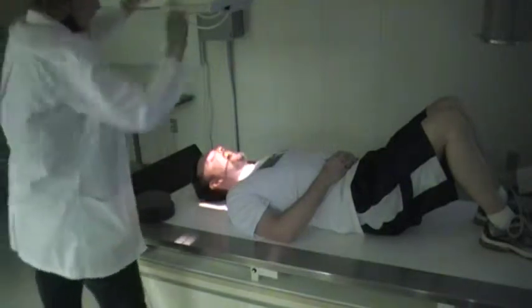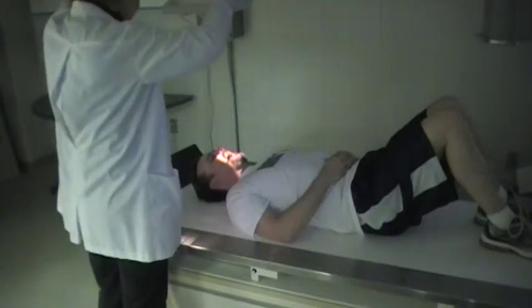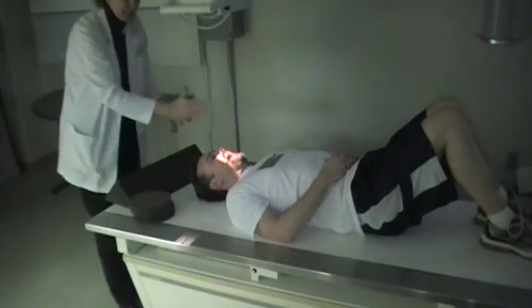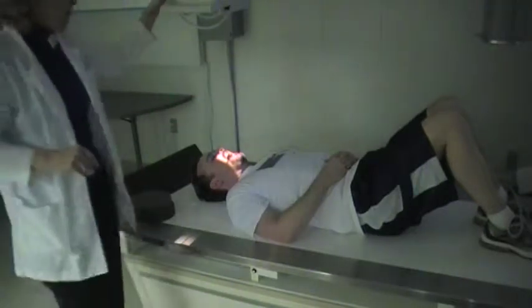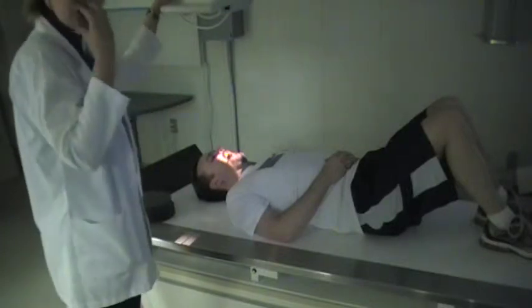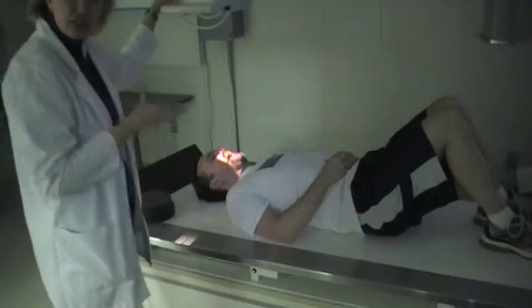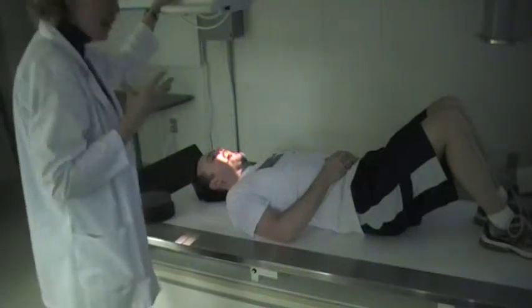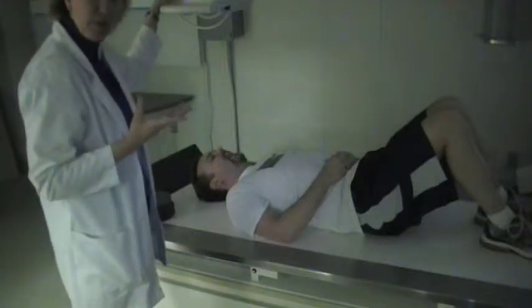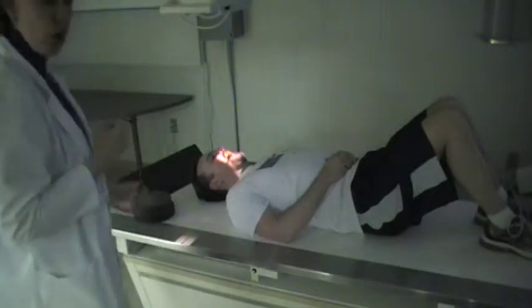Double-check your light field — make sure you are going straight through the mouth. Collimate down and make sure that the head is straight because you want it going mid-sagittal. You can have the patient phonate 'ah,' which places the tongue at the bottom of the mouth. Not everybody is going to be able to do this — it all depends on whether the patient is cooperative, since it is a trauma patient and you never know the situation. But that is our open mouth view.